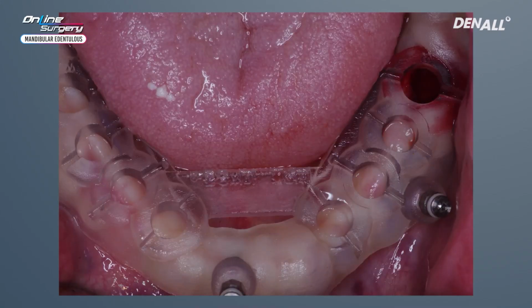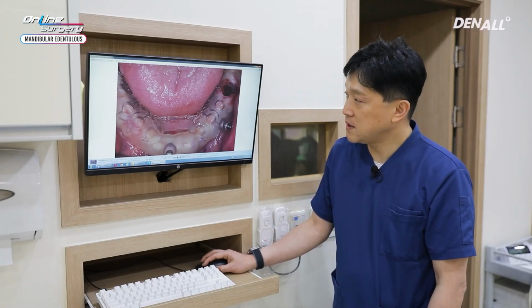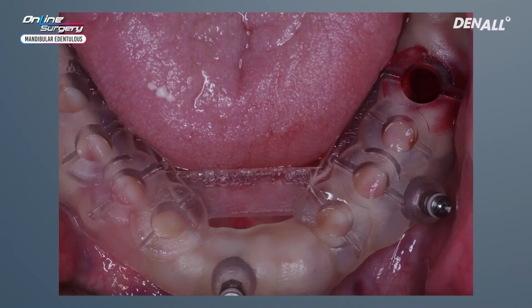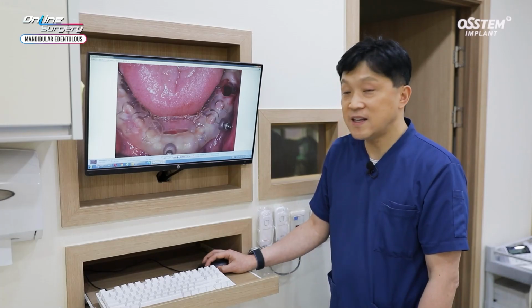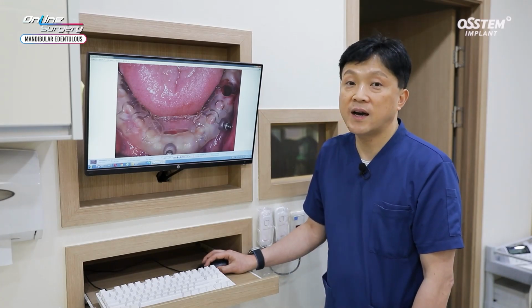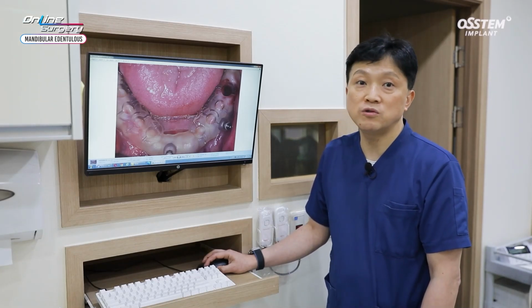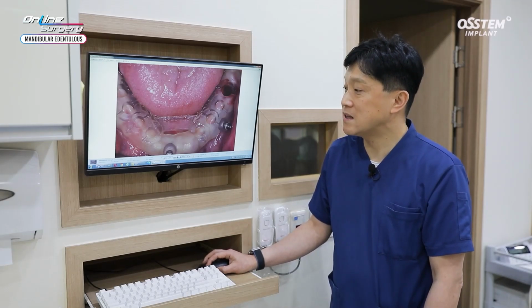Template was adapted. Three anchor screws were used to fixate the template. To check the level of adaptation of template, as you can see, after template is adapted and fixated using anchor screw, the gingiva is bleached. The white color indicates that template has been adapted appropriately. If the color of gingiva remains intact despite fixating using anchor screw, then it means that adaptation has not been done properly and you need to adjust it to proceed with accurate surgery.